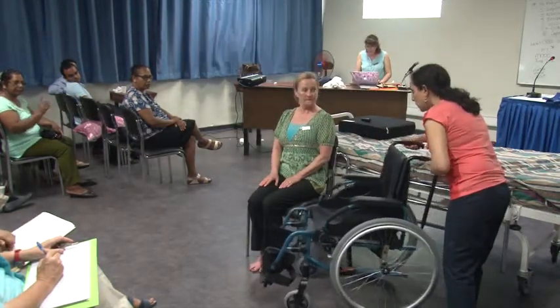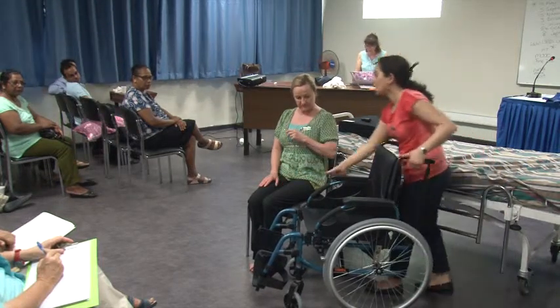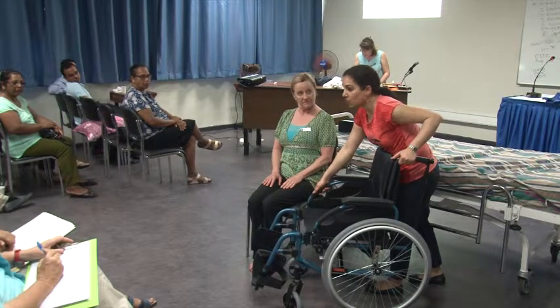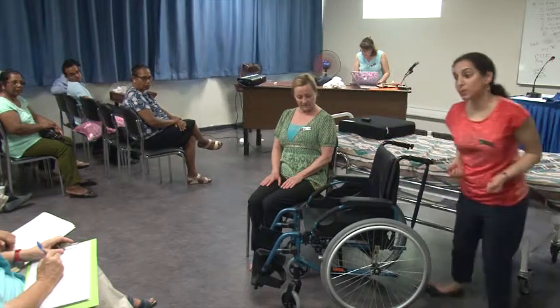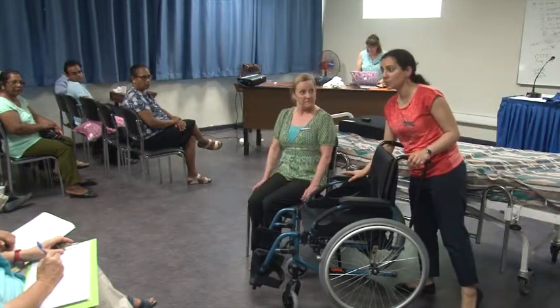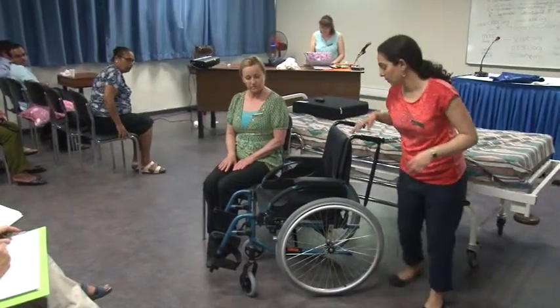Now, we've come across most of the chairs that do not have these. Yeah. They don't come off. You can't do the transfer if they don't come off. Right? You will have to lift. There's no other way to manage it. So you have to have chairs where the armrests come off. Okay?